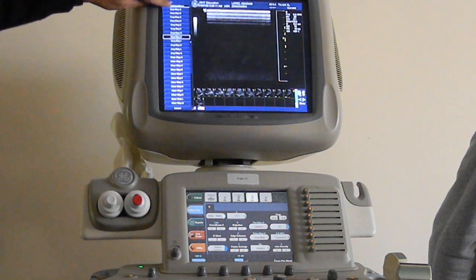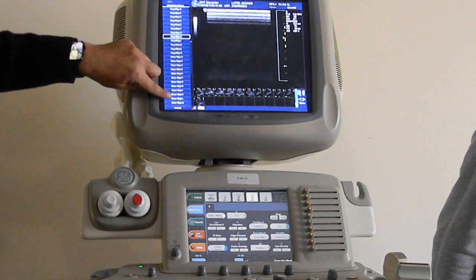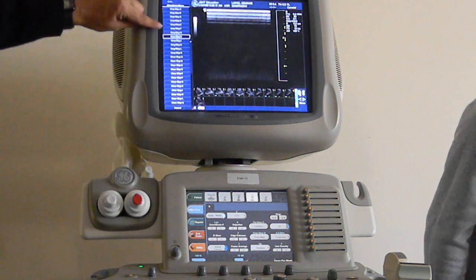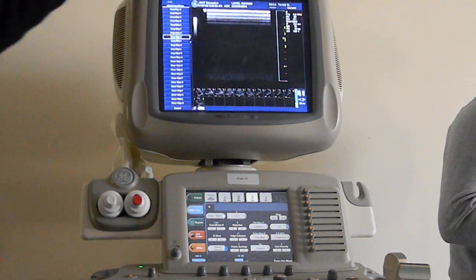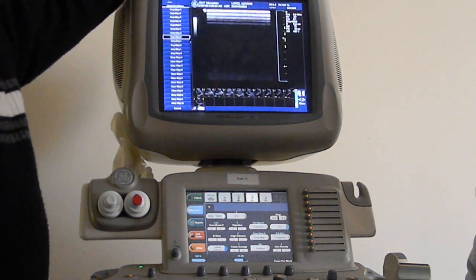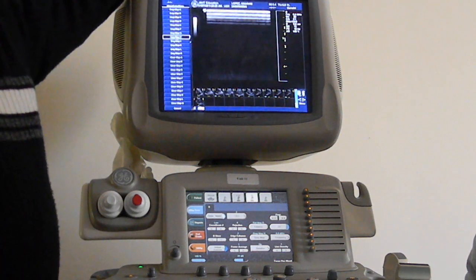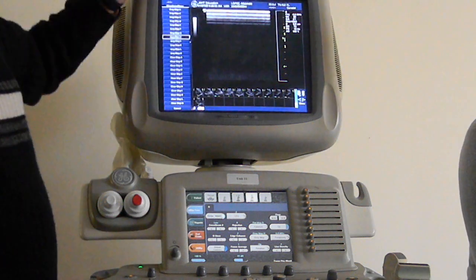And here is a long list of maps. A, B, C, D, and so on. Right now it has chosen H. Generally, whenever the system turns on, it automatically chooses a common standard. But if you, for instance, want to change your gray map.